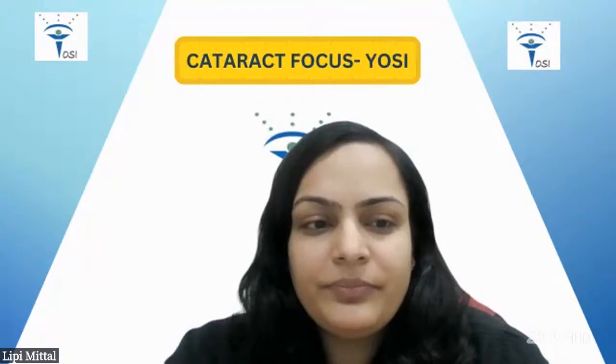May I ask, why did it happen with you? What do you think? What is your analysis? Why did the capsular block syndrome happen in your case? When did it happen, Dr. Juhi? Hello, am I audible? Yes, you're audible. Yes. So, I think in my case, it was the pressure that I was putting. I was putting a lot of pressure while injecting the fluid. So, it could be one of the reasons.